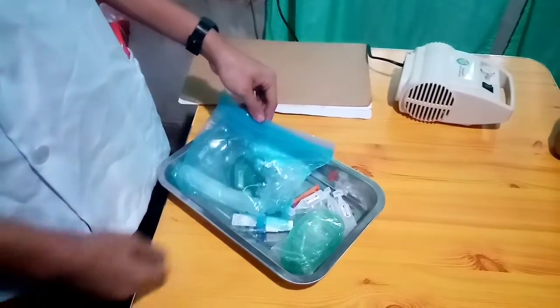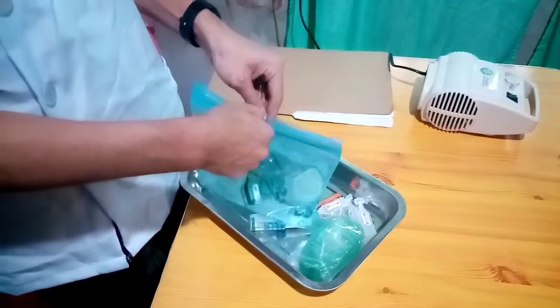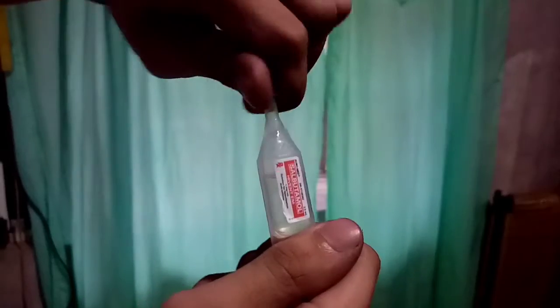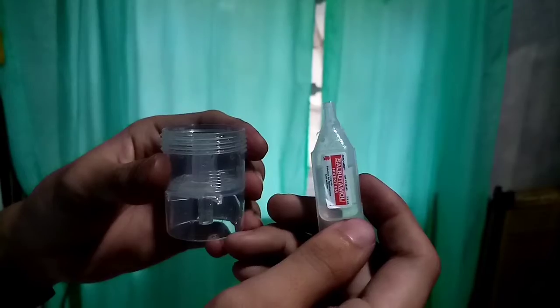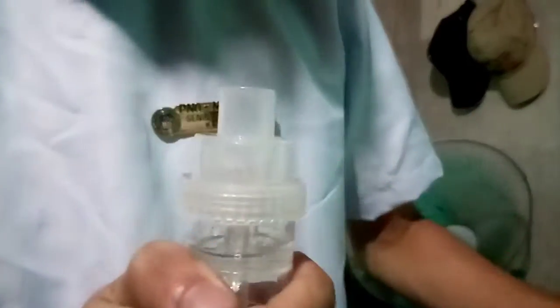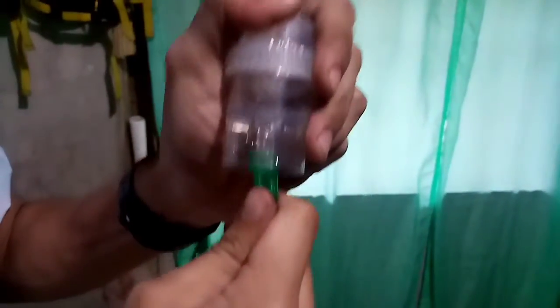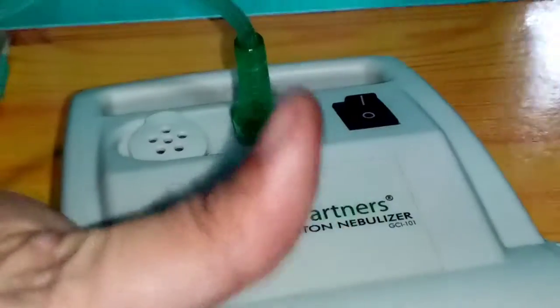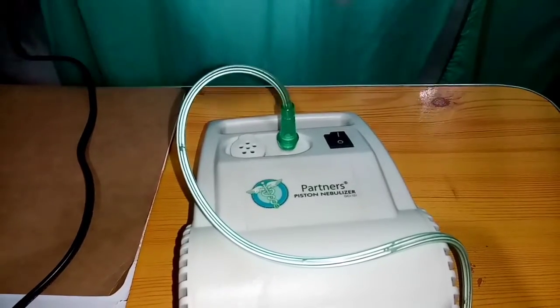Fill the nebulizer cap with the ordered amount of medication. Turn on the air compressor.